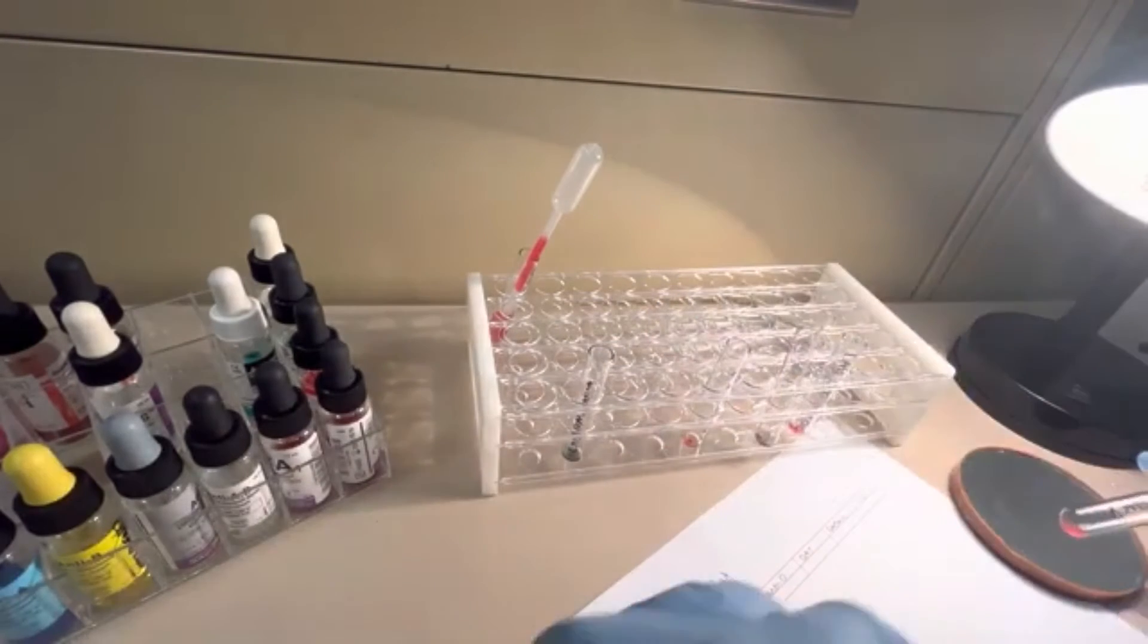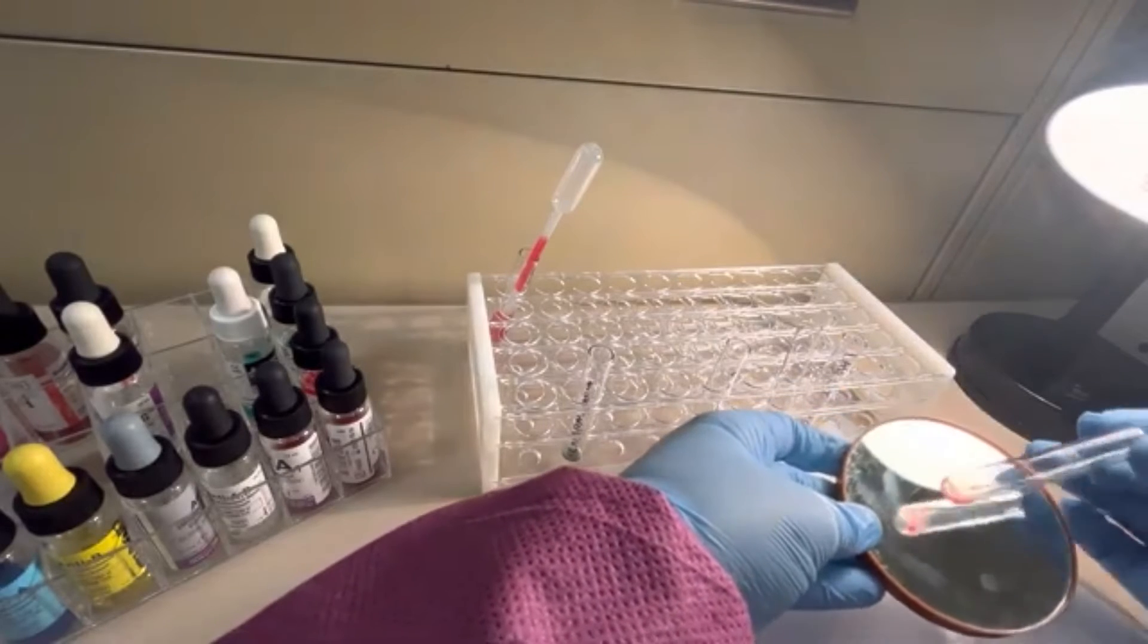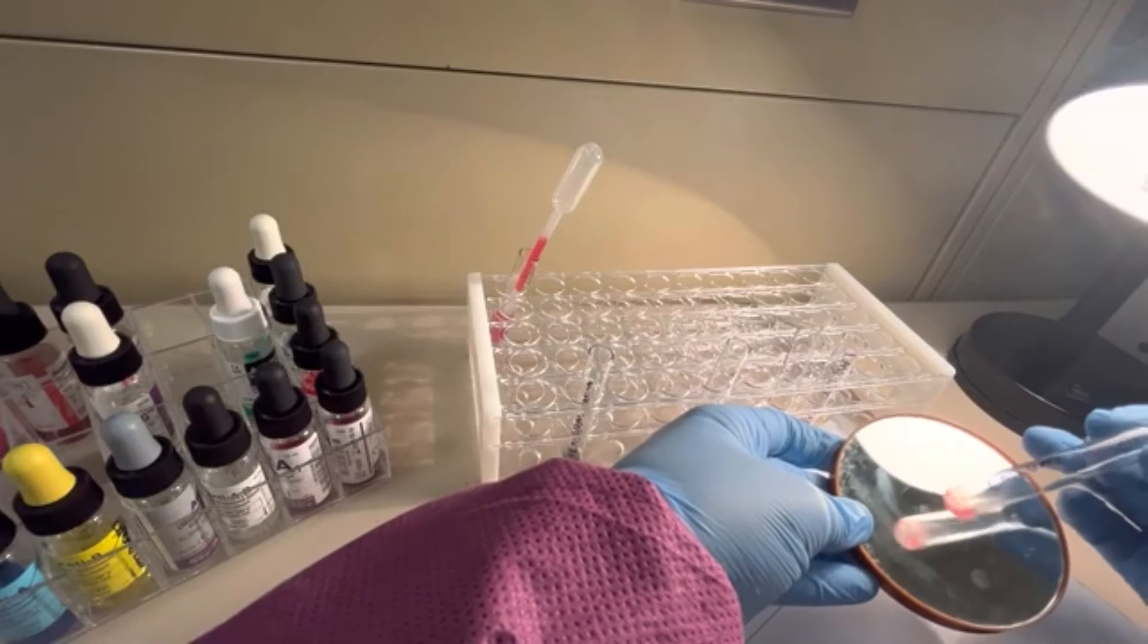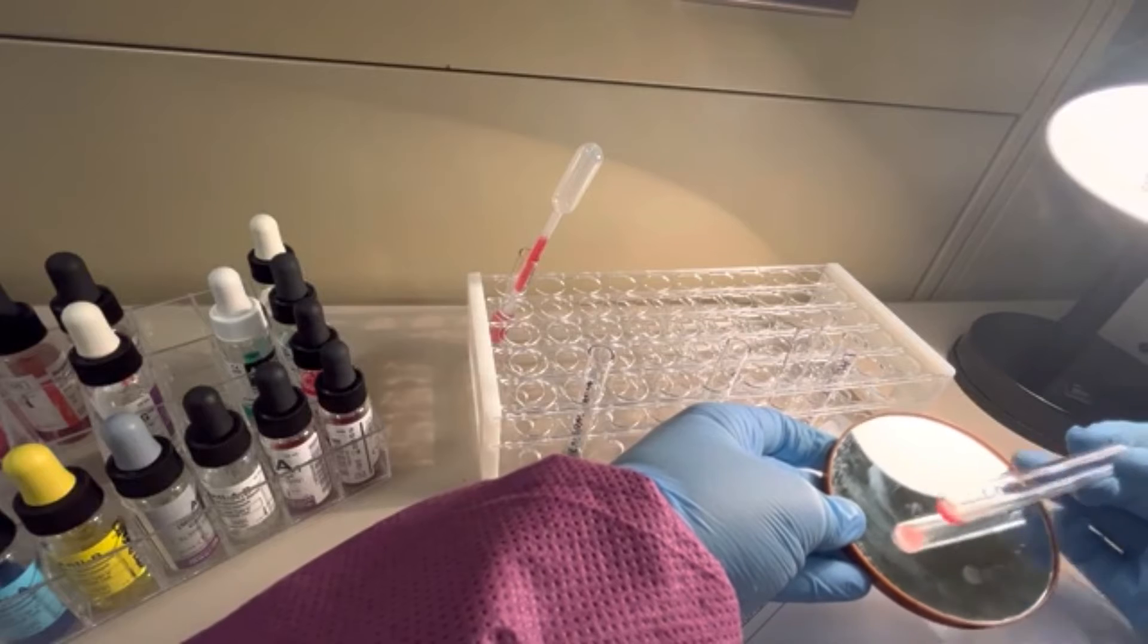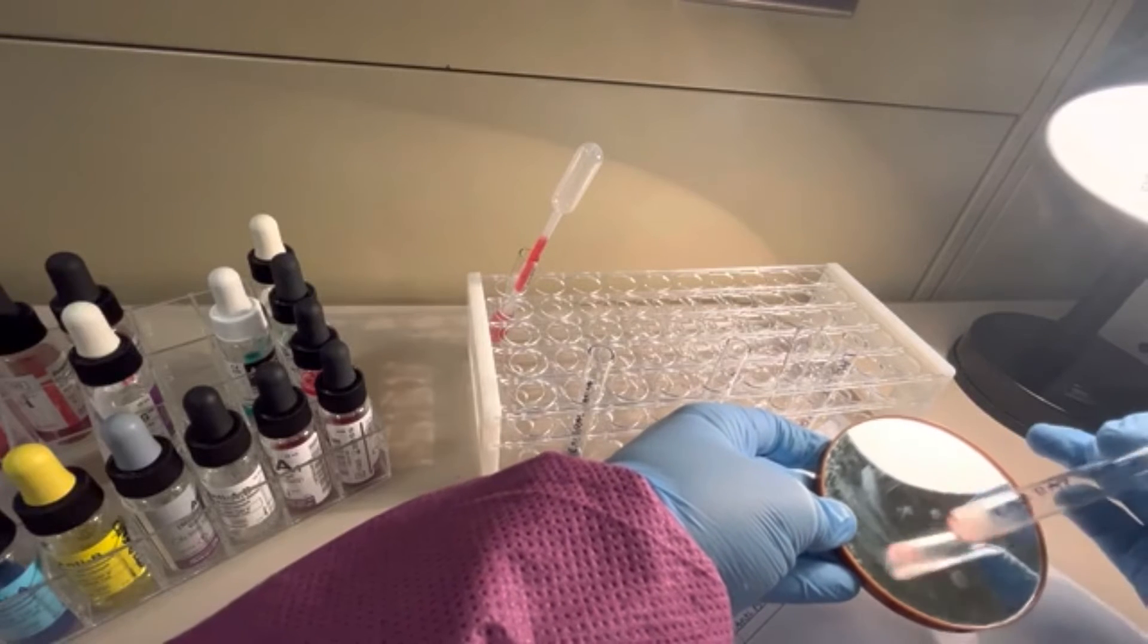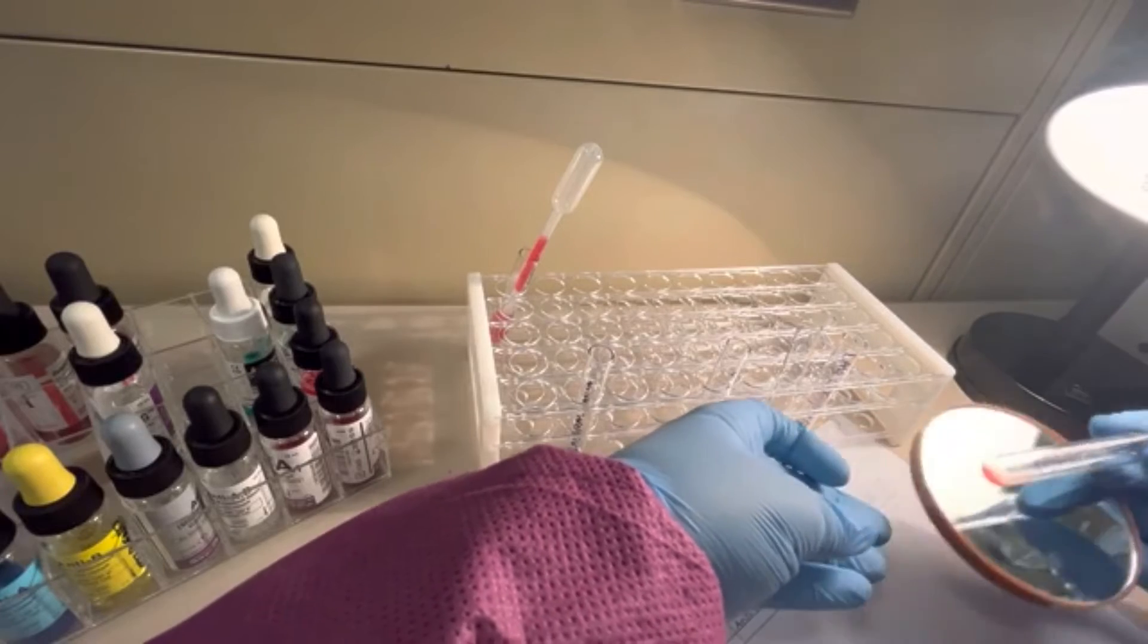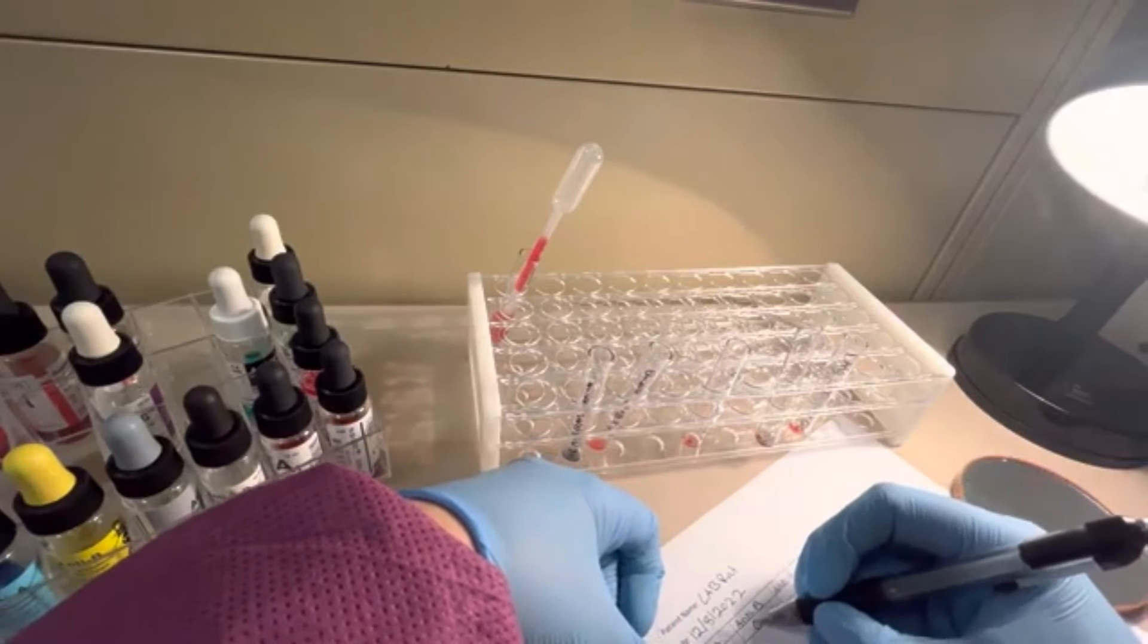Now I'm going to take my anti-B tube. Oh, this is probably going to be negative. I can tell the way it's coming off that cell button. But let's completely get rid of that cell button first before we call it. Excellent. There's no agglutination whatsoever. Anti-B is going to be zero. I'm going to record that.